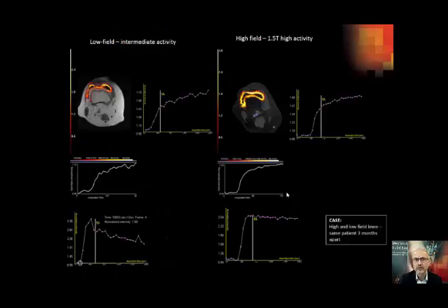As I told you, the DCE-MRI method is applicable in every anatomy that you can think of. It doesn't necessarily have to be applied in inflammatory joint diseases. It can also be used in cancer, or oncology, infection, and in autoimmune diseases of other areas.